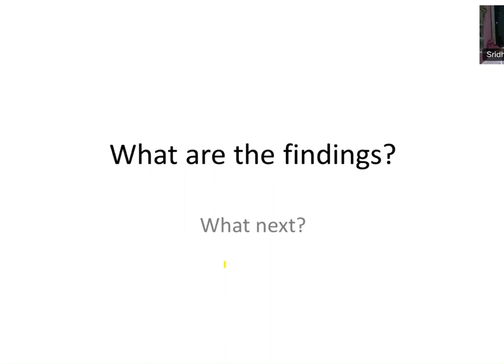So what do you want to do? You have a 28-year-old lady, a diffuse glioma of astrocytic morphology. How will you confirm or negate your findings? Is there anything else you want to do? Or if you want to classify based on the current classification, what do you want to do? Go for an IHC. What IHC do you want to do?